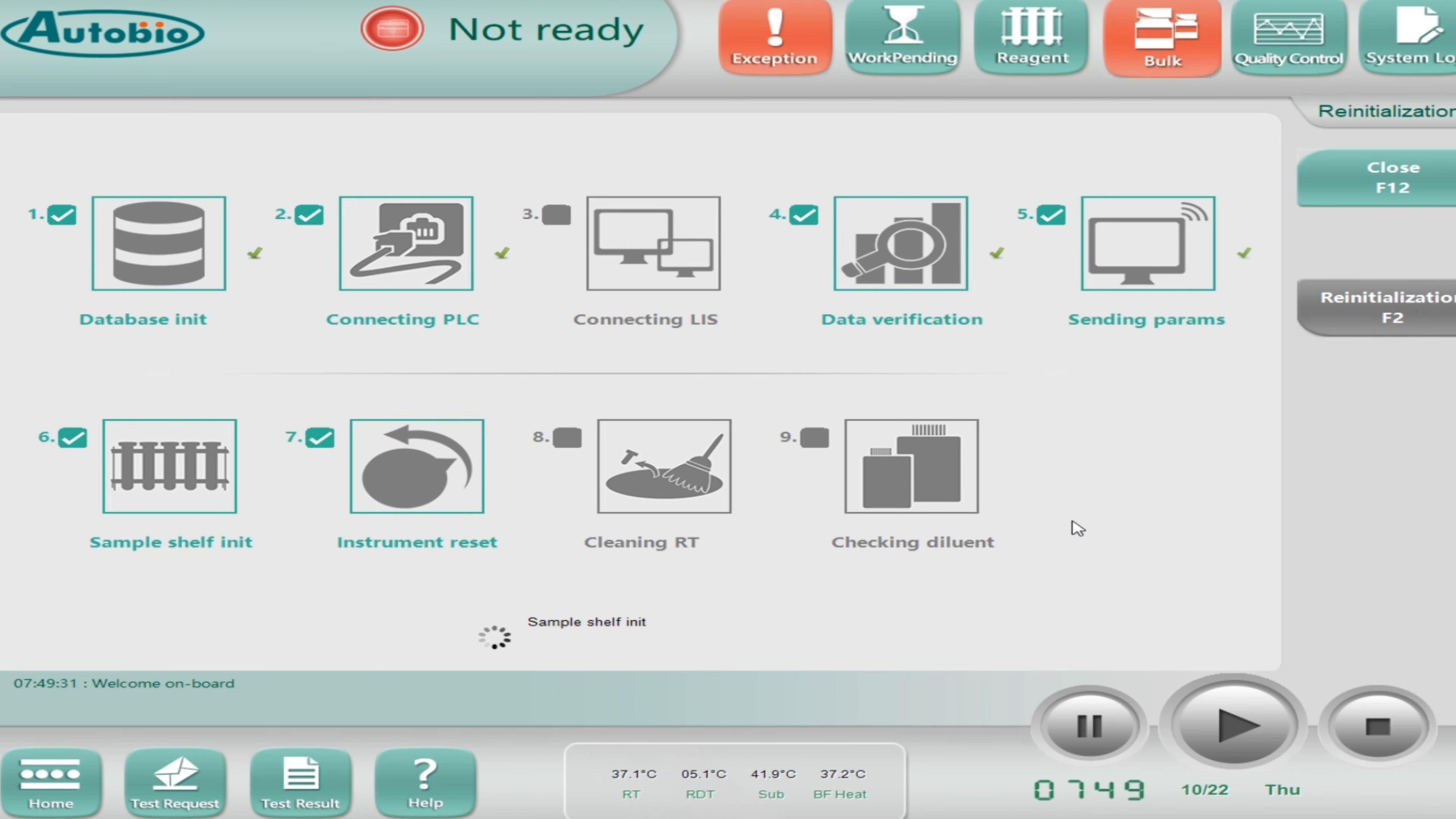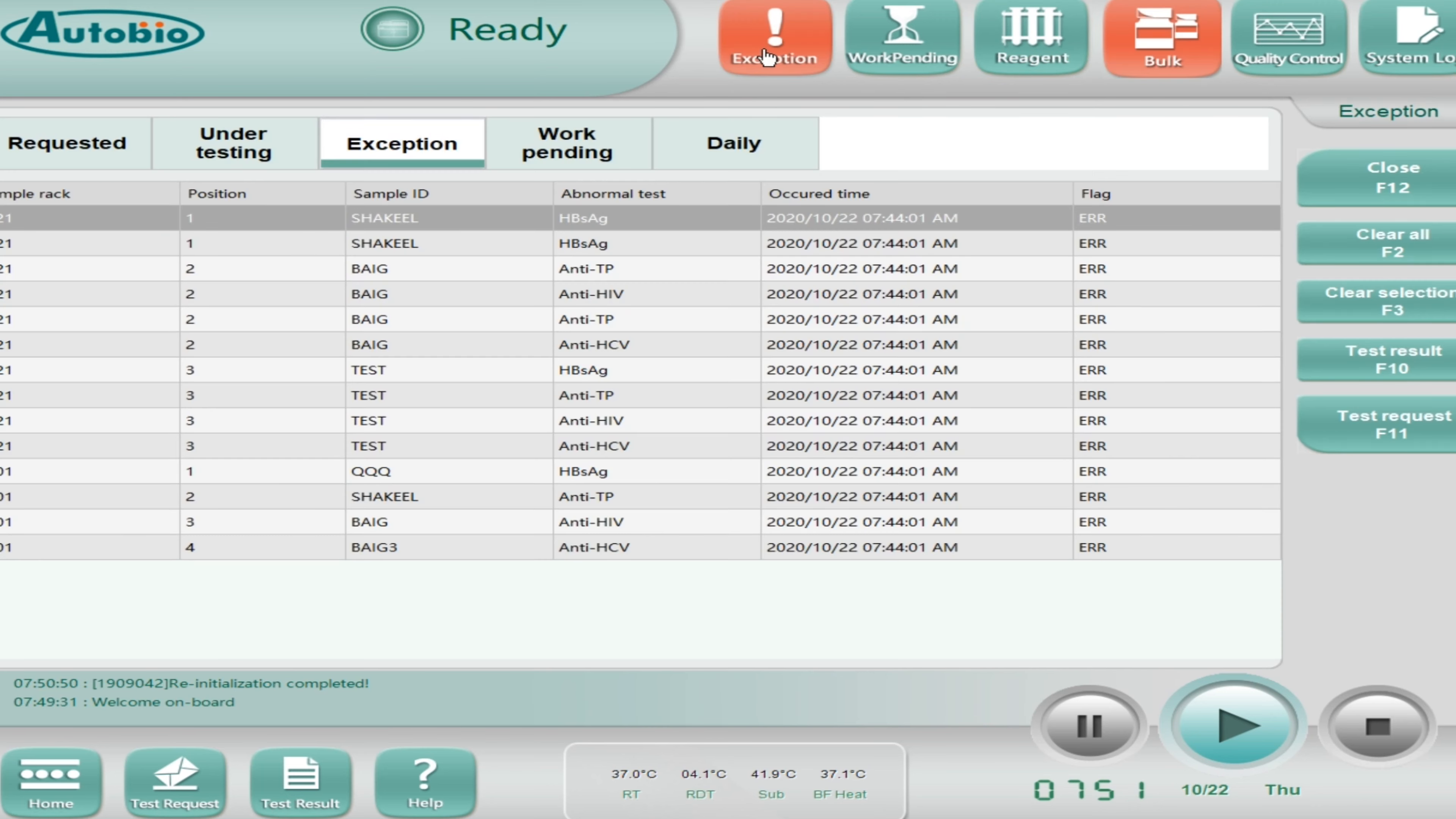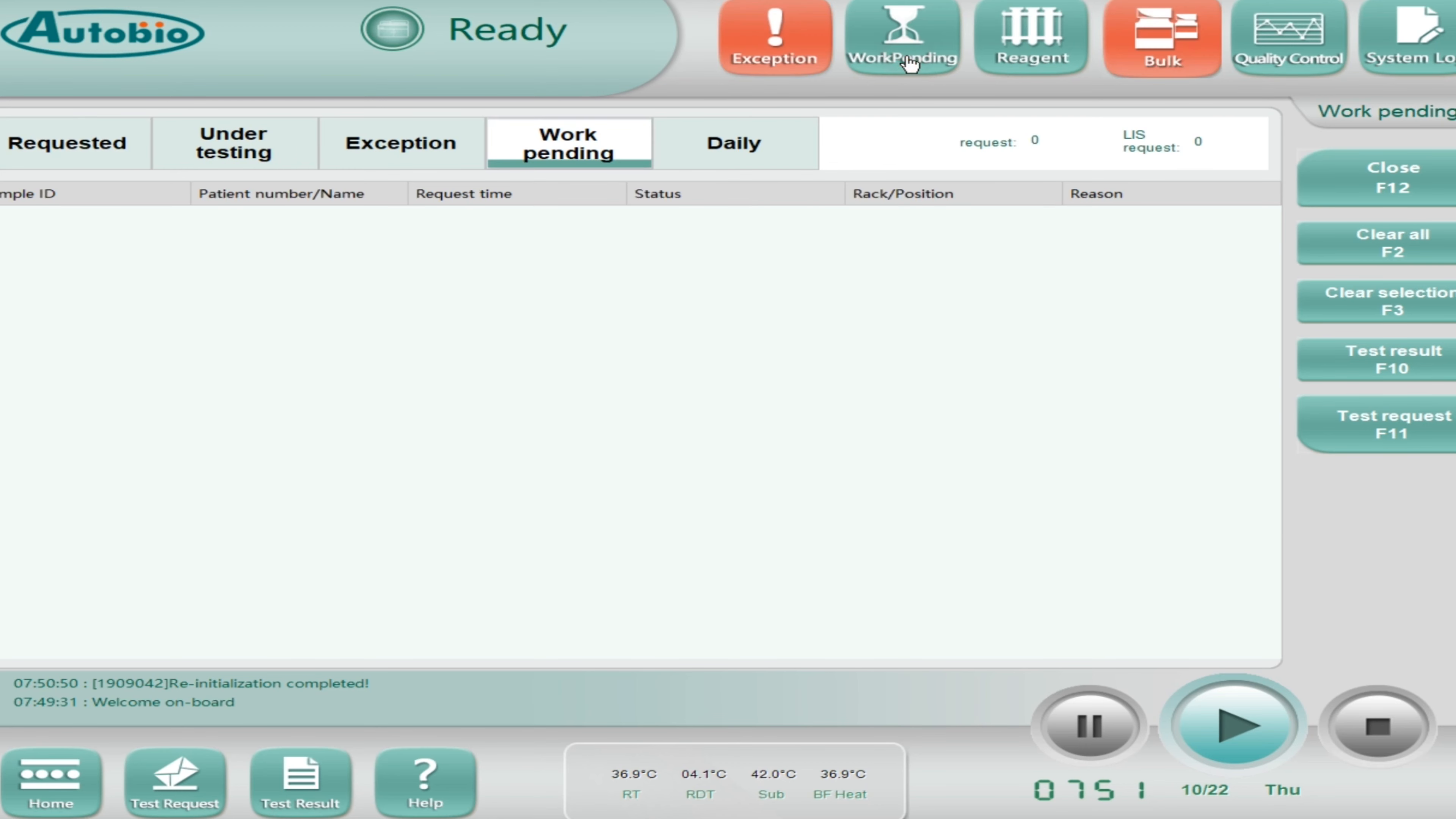Let's open this software. Now software is communicating with the analyzer. So here you go. Whenever software will start, its first status will be not ready.